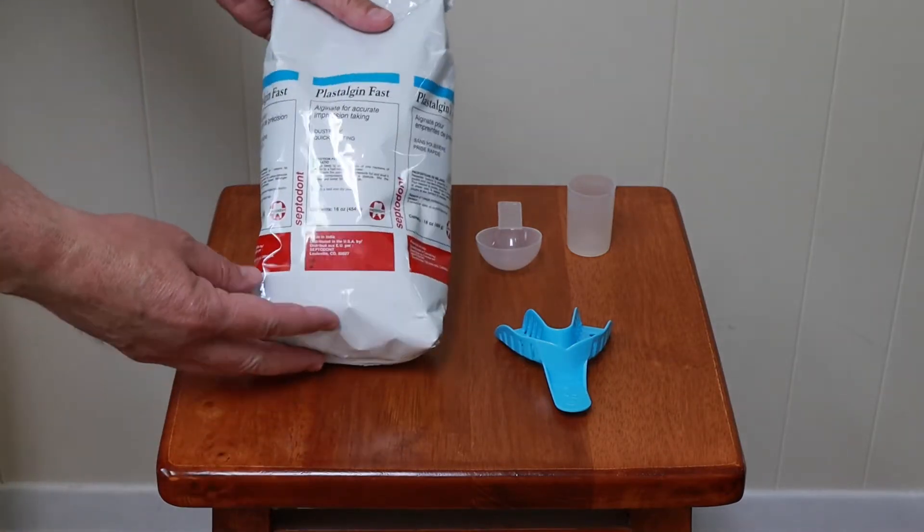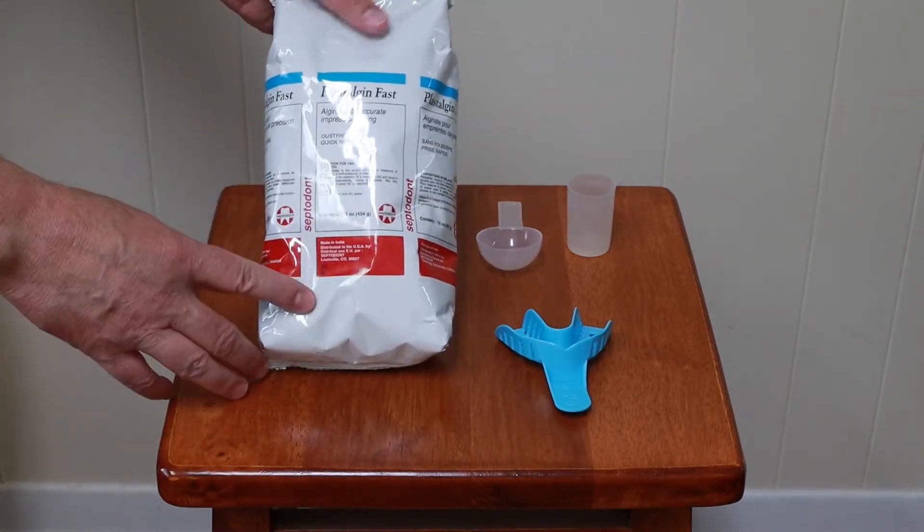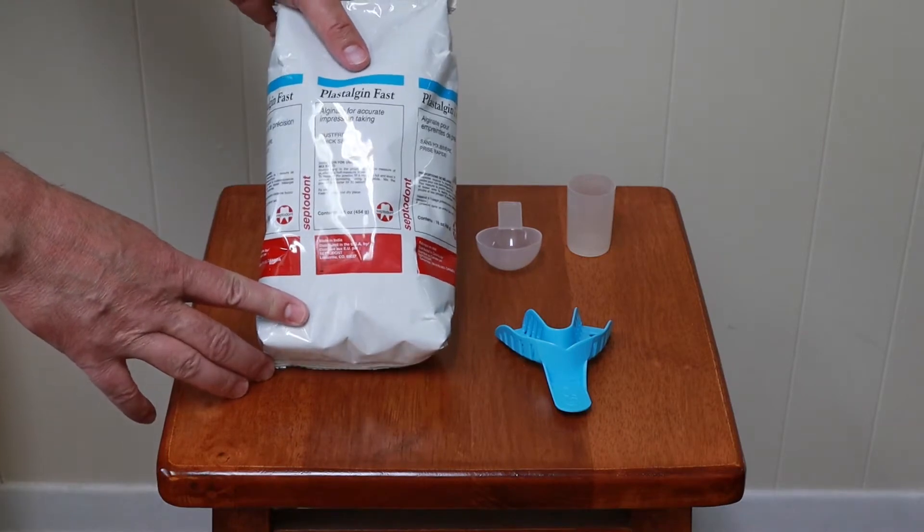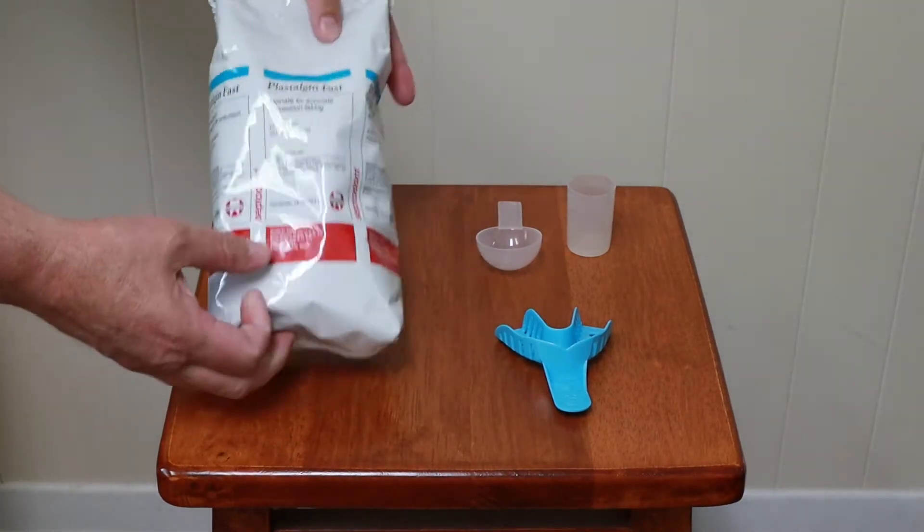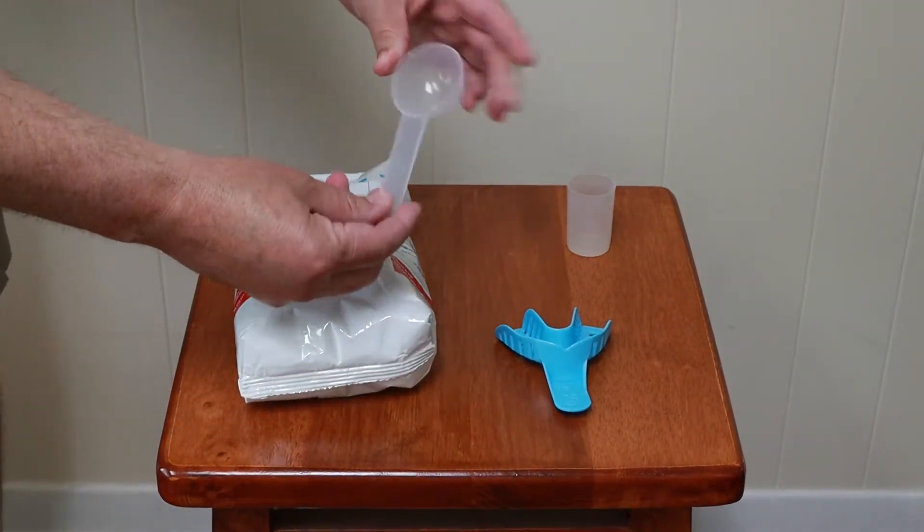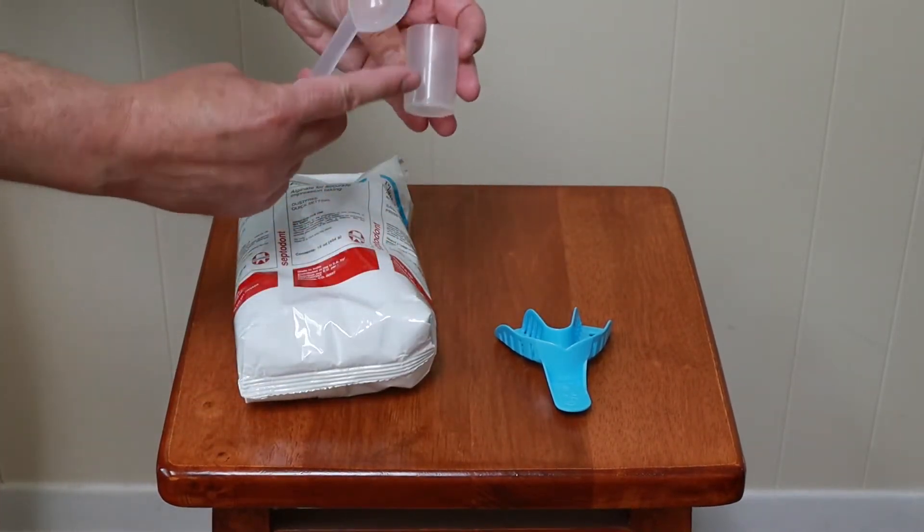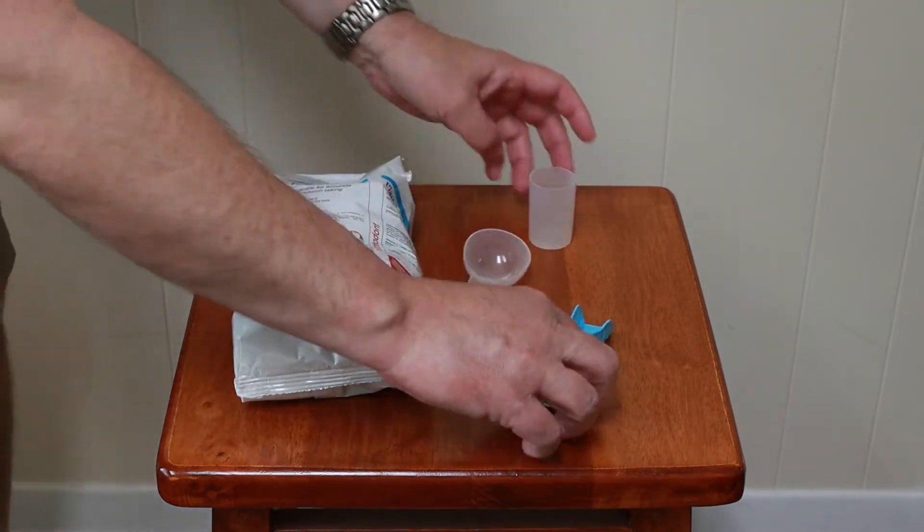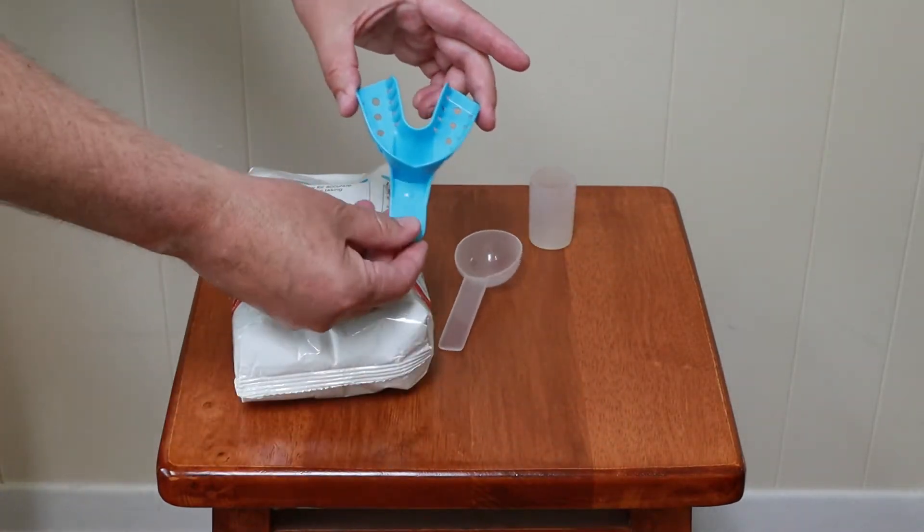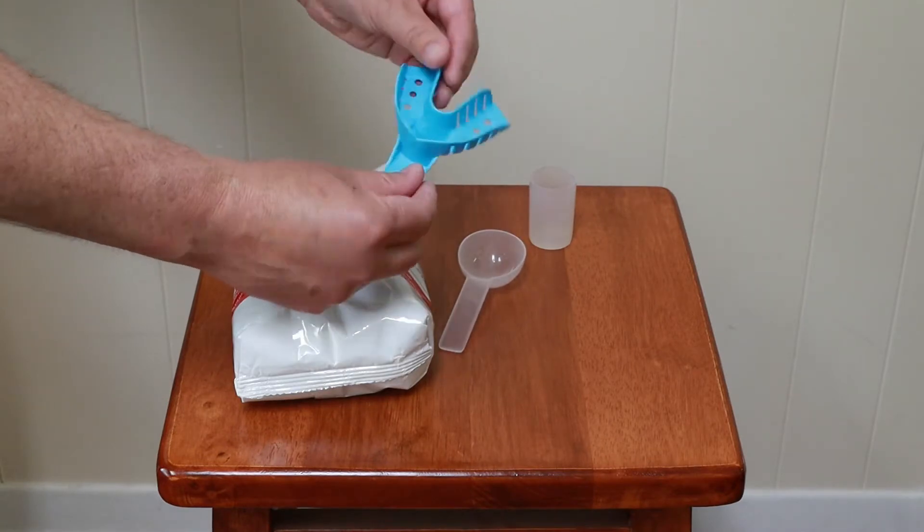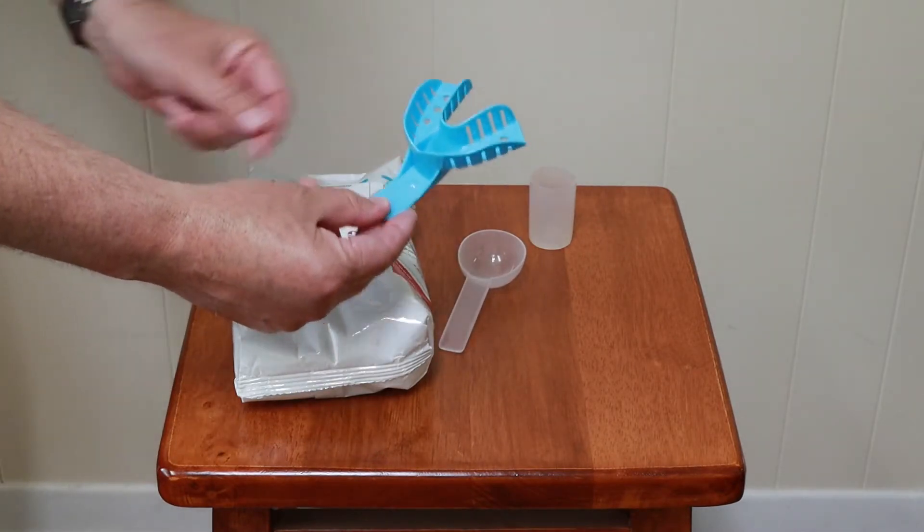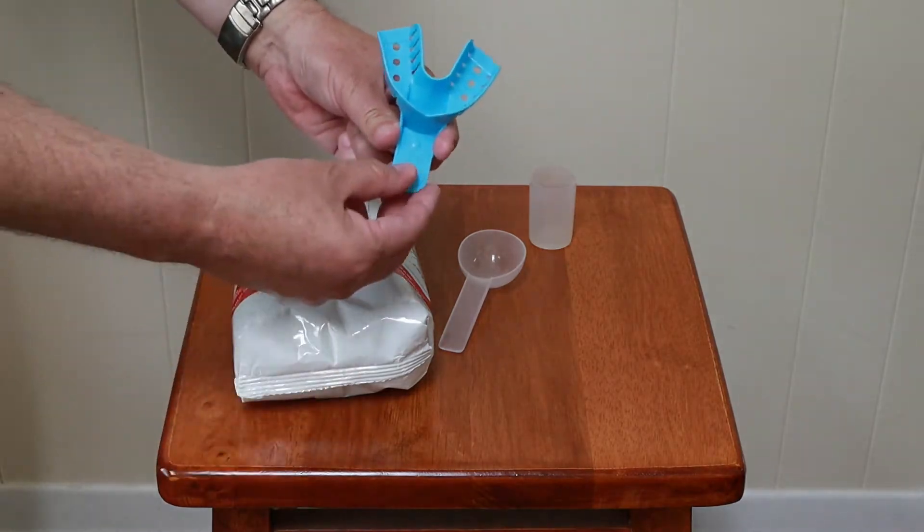So, what I'm going to use, here's the alginate that I'm going to use. The brand I use is called Plastalgin. It's a fast set material made by a company called Septodont. The powder comes with a scoop and a water measure, and then here's the disposable impression tray that I'm going to use. It's a medium size that fits my mouth. I've used it in the past, so I know it'll work.